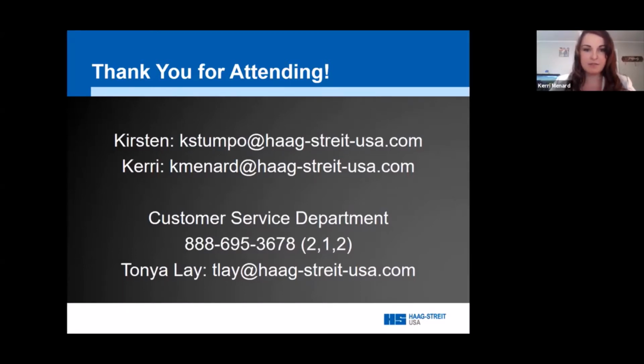So actually, we had another question. Piggyback lens calculation is possible? Not within the Lenstar. So we recommend that you go online to do additional calculations on an online resource.